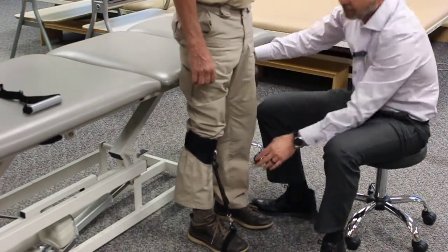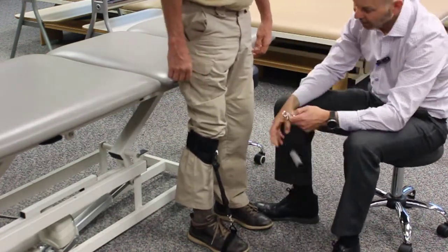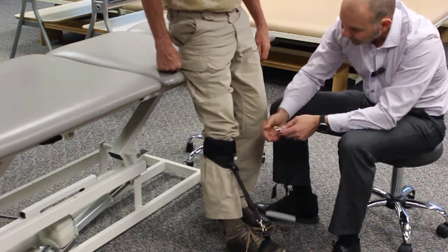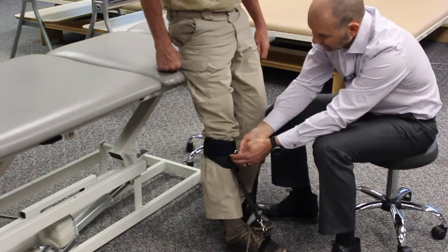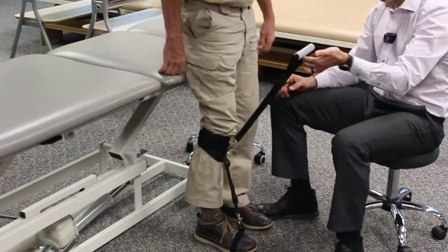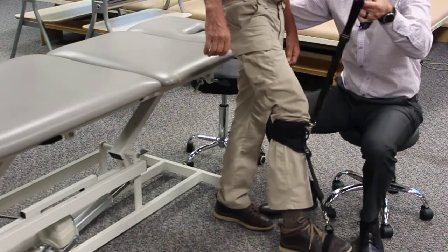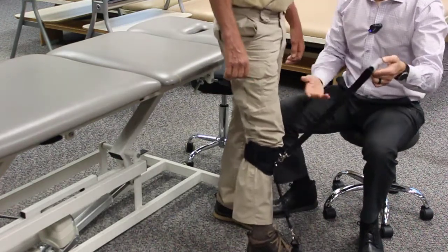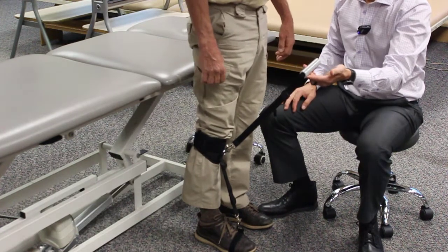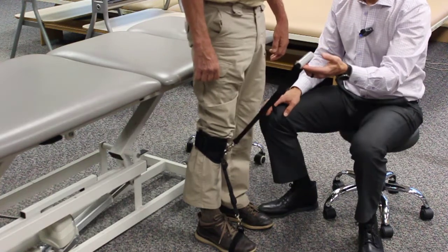And then the other thing we can do is we can utilize a handle, and the handle connects to the triangle that is sewn to the cuff here. And if we just clip the handle to that, now we can also adjust the length of the handle. So now I have something I can use to assist with lifting the leg either up onto a step or during any gait training, whether that be a treadmill, with a walker, with a cane. It just allows me to help move the foot into swing during those gait training procedures.